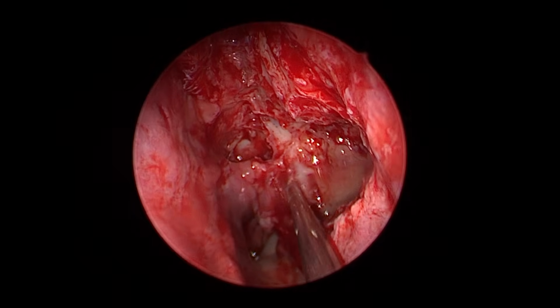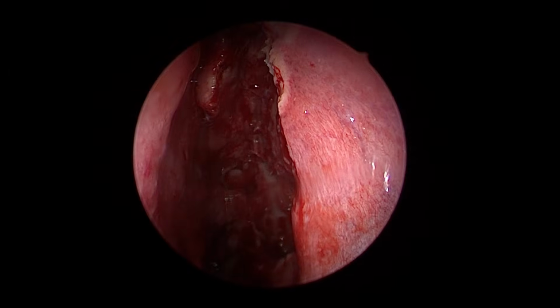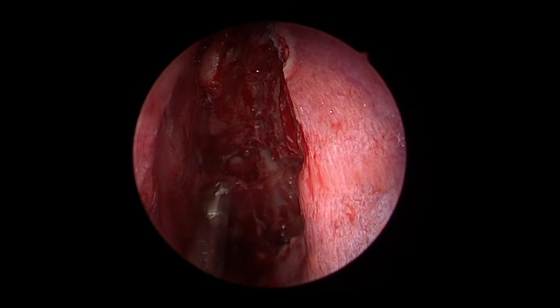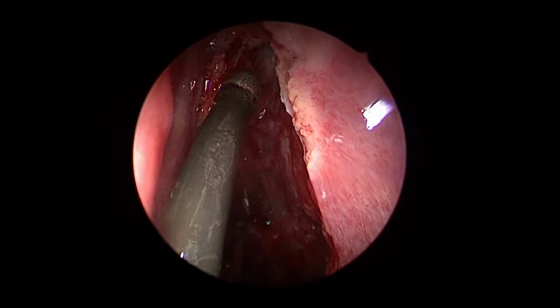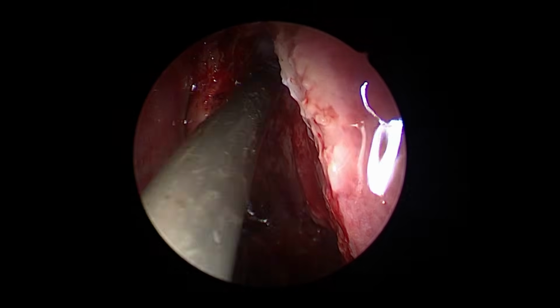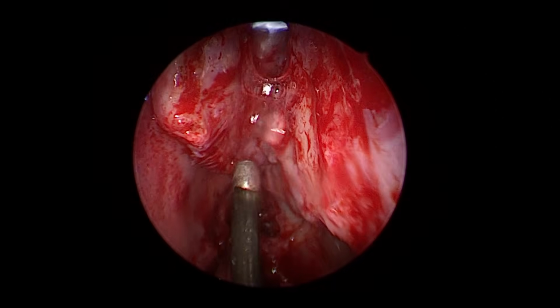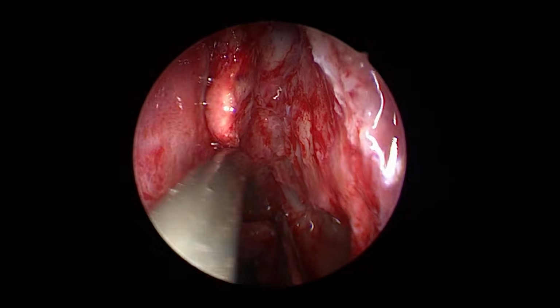Yes. See now? That's the kind of work required. Now imagine somebody asked me what is the need to operate in this case. Could you justify adequate surgery by the previous surgeon? If that is not justified, first do your homework and then train your patient for the topical. If you don't give a good access, don't expect a good result.